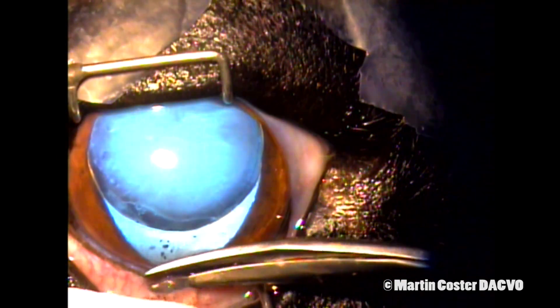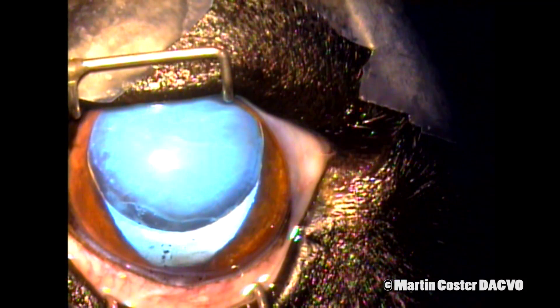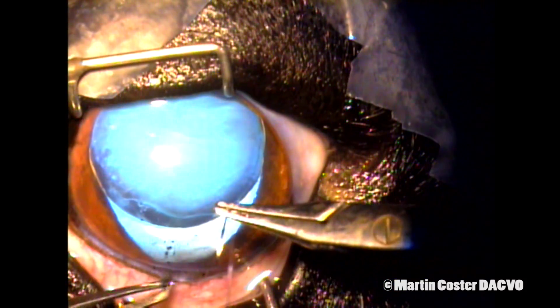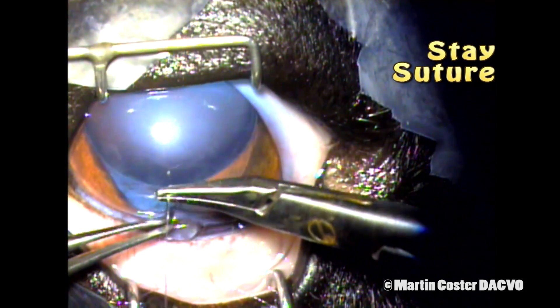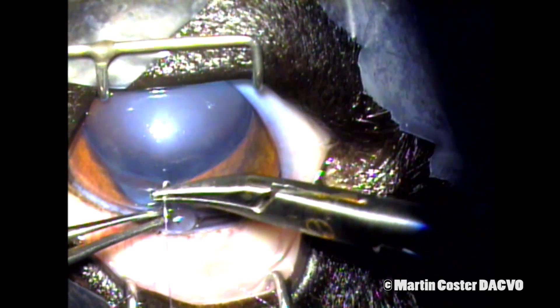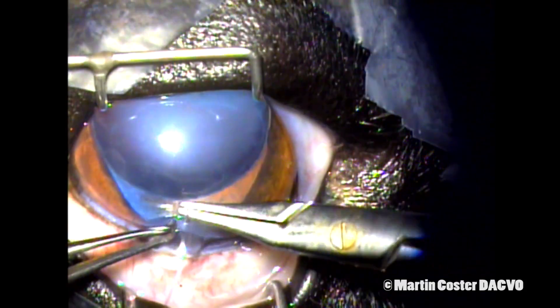I'm then here using some scissors to trim or cut off the protruding vitreous so that I can place a stay suture in the central cornea, which will help with positioning of the eye and moving the cornea later on in the surgery. You'll see some more vitreous slowly protruding from within the stab incision.